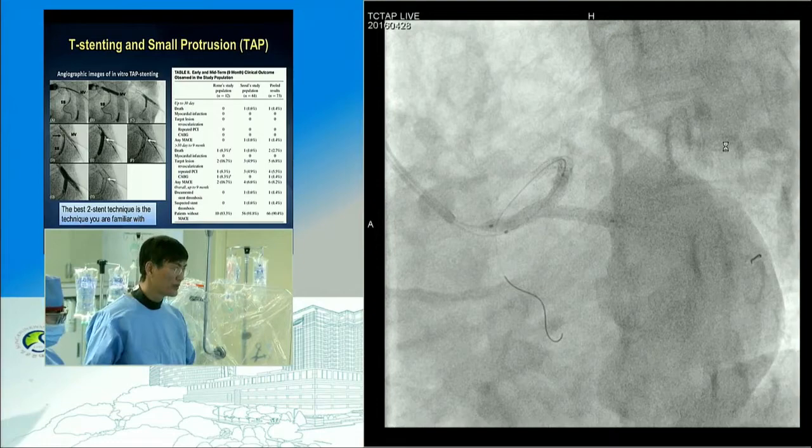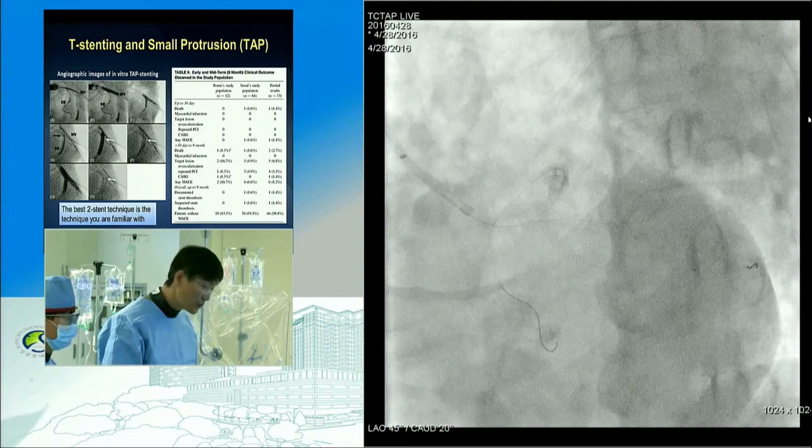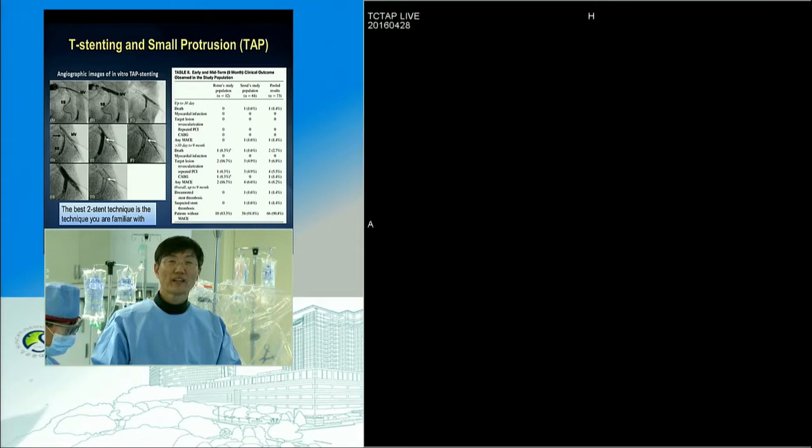Us some final comments of your case? Yeah. Final comment is this is it. This is the end. I would like to show how convenient this stenting is. So stenting and kissing and you can finish the procedure even here. The main advantage of this stenting is the most predictable and easiest way to decrease the perioperative MI.